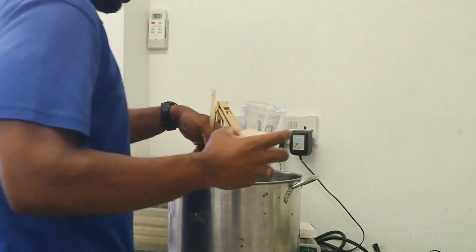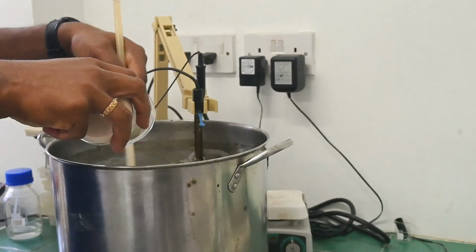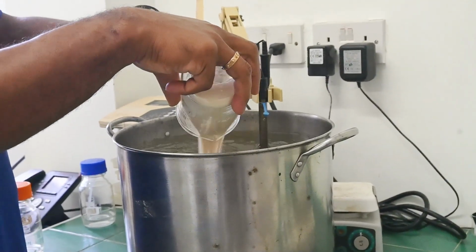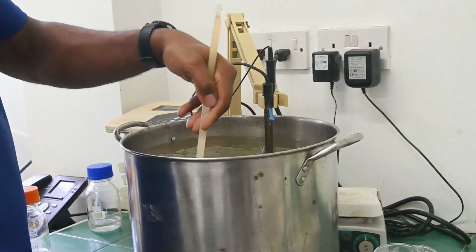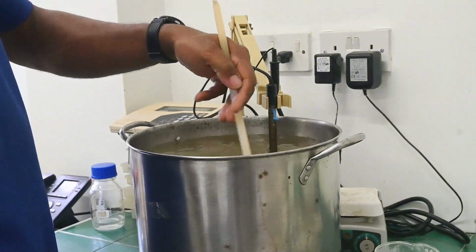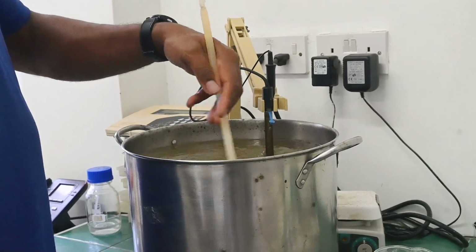When we get our final volume, we go to add the gelling agent. So we slowly add the agar-agar gel or the agar powder to dissolve it. It changes the color of the media slightly, so it's not as clear as it was. But after it is autoclaved and all the agar is dissolved and uniform, it will be clear.